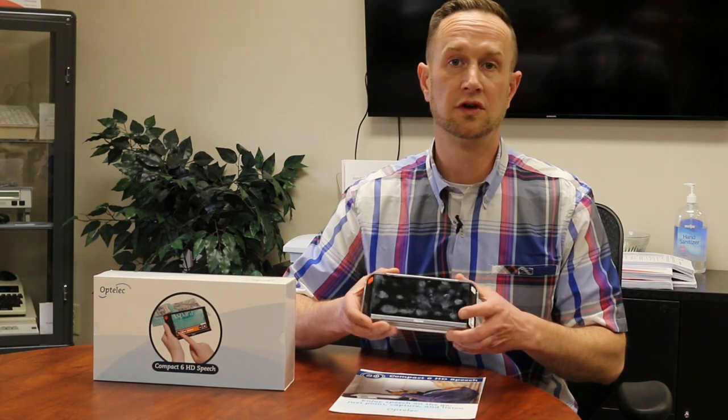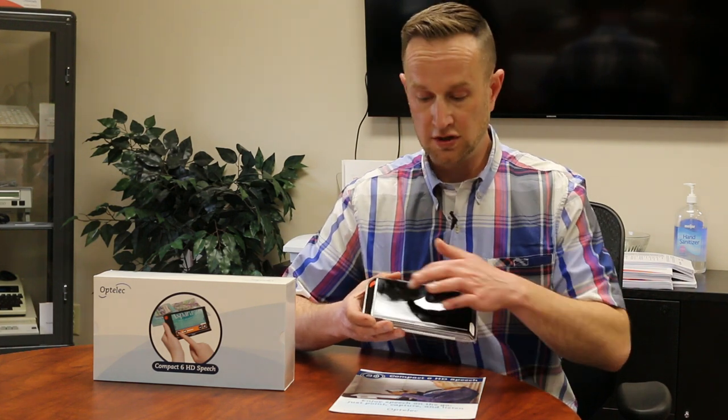What really separates it is that you have an extremely high-quality portable video magnifier that also does really high-quality OCR. Once you do the OCR, you control it all on the touchscreen. After taking a full picture of an 8.5 by 11 page, you can navigate that page as much as you want — move up and down, zoom in, zoom out, and start and stop playback from wherever you want. This is a really nice handy device called the Optelec Compact 6 HD Speech.